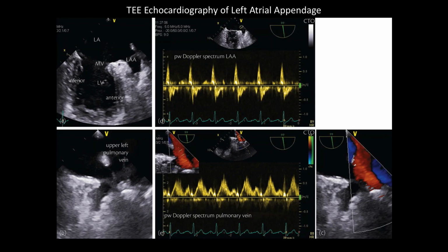And it was probably one of the first interventions. It's not truly interventional because topologically you're still on the outside of the body, right? It seems like you're on the inside, but you're a tube, right? So you're still actually on the outside of the body. And so you put this tube down there, and it's probably the first type of ultrasound thing they stuck in people.